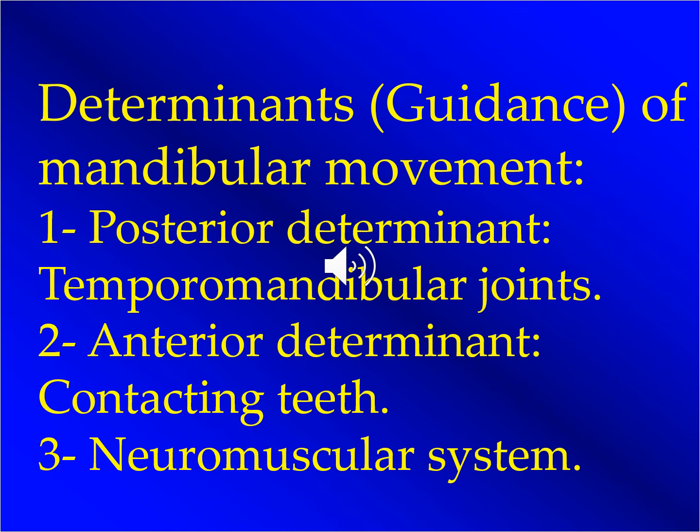Now, if we do protrusion, we know that there is going to be a space posteriorly that is caused by the inclination that the condyle has to travel against when it moves forwards. So when it moves forwards in translation, it has to move downwards as well. And when we move it to one side, it has to translate downwards on the non-working side. Also the anterior teeth, because they have overjet and overbite, will force the mandible to move downwards.